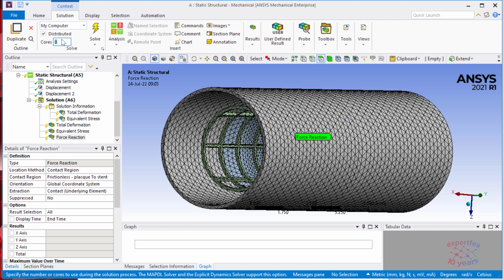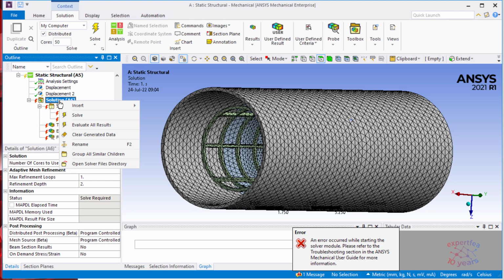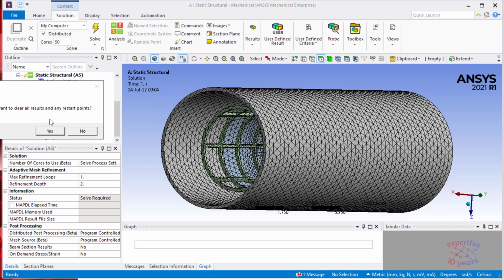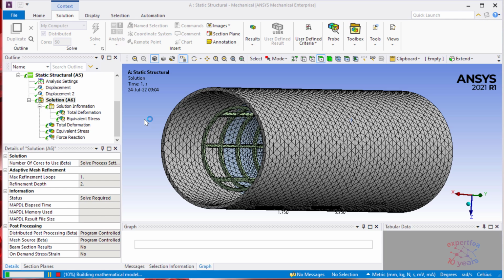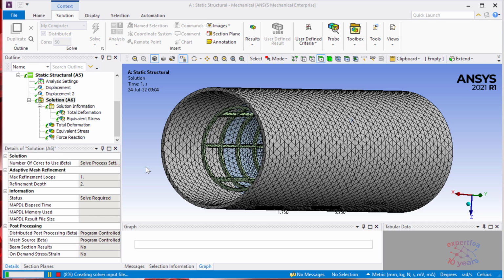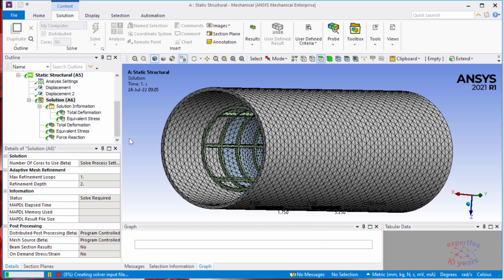So let's go close to what we have. Maybe 50 is enough. Solve. And we're going to look inside. When you have such an error exactly from the start, you need to just clear generated data and again and again try to solve it. Yeah, thank you ANSYS for these bugs. With a little patience, we can start the FEA.